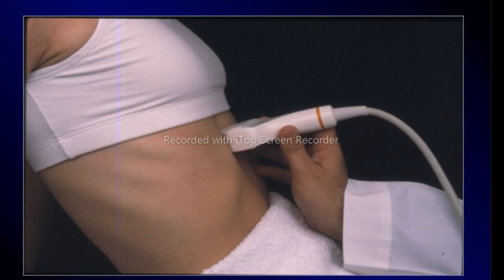That fluid could also be other things, could be pus, could be blood, but for now we are just dealing with the anatomical orientation. Asaf, I hope I've answered your question. Again, this is just orientation.